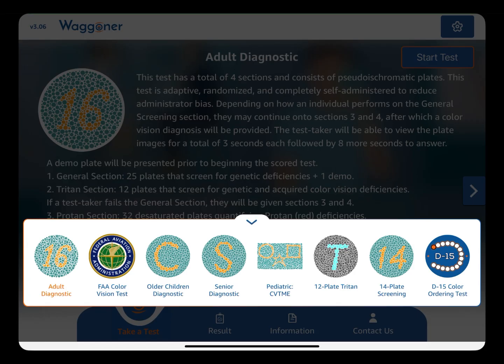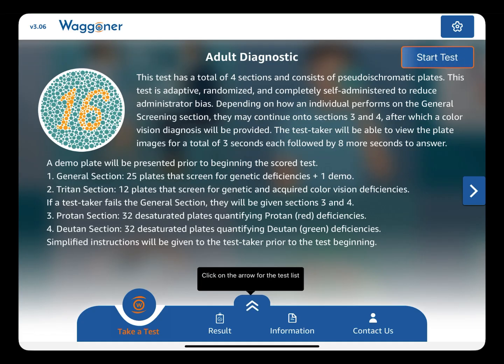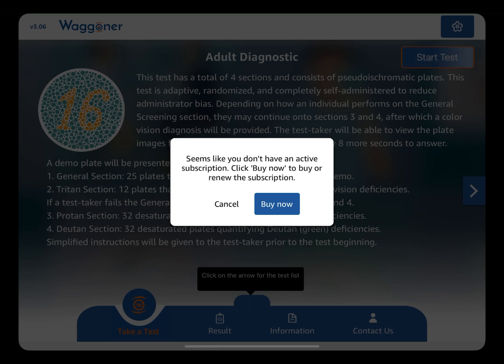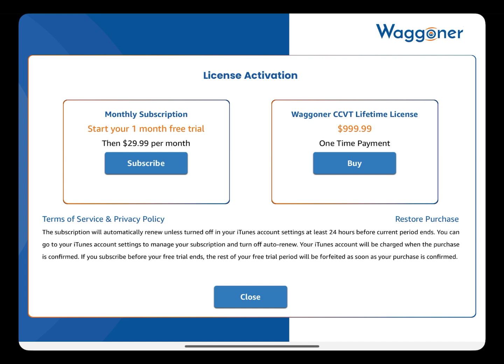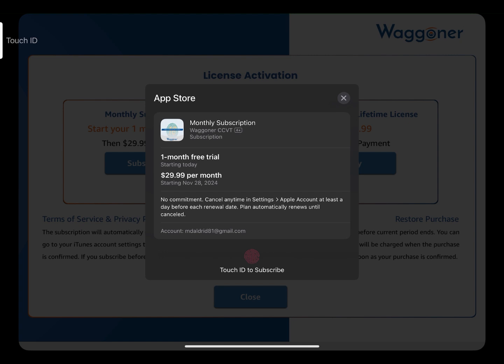You are now in the app. There is just one more step to activating your license. Click Start Test in the upper right, then click Buy Now. Select your preferred plan and complete your purchase.